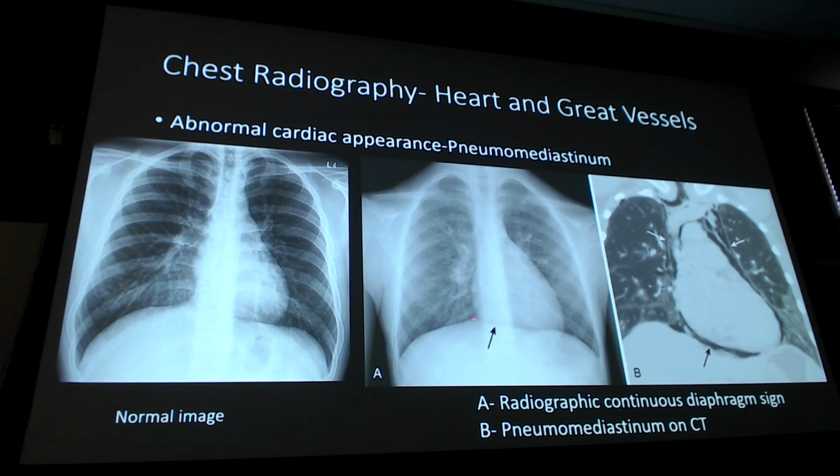when I have a continuous diaphragm sign, and I can trace it all the way through, that is one of the signs that there is a pneumomediastinum on X-ray. Can everybody see on that second picture, I got the black arrow too, how you can actually trace that diaphragm all the way through? One straight line. If I was looking at the crayon, I can go one side all the way to the other. Here I can't do that on my normal.